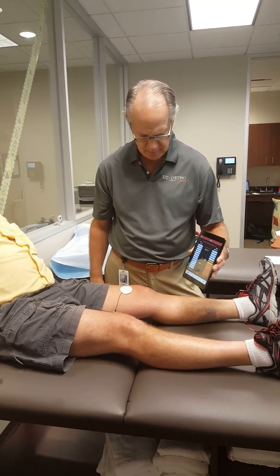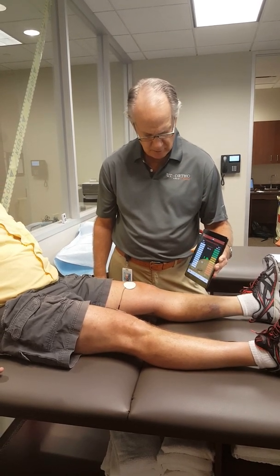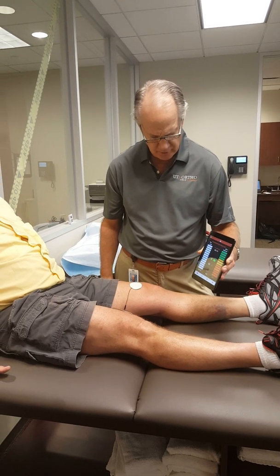So we're like two weeks post-op. Squeeze hard — and he's doing really well. Squeeze hard, hard, hard, hard, hard, hard, hard, and relax.